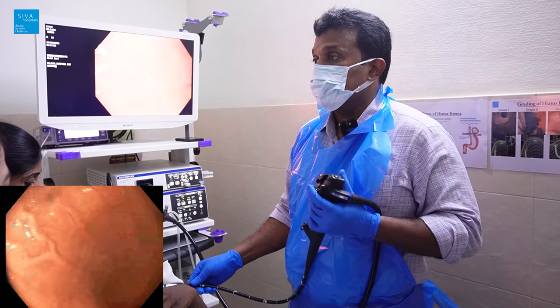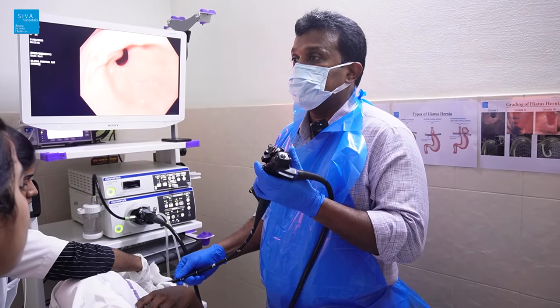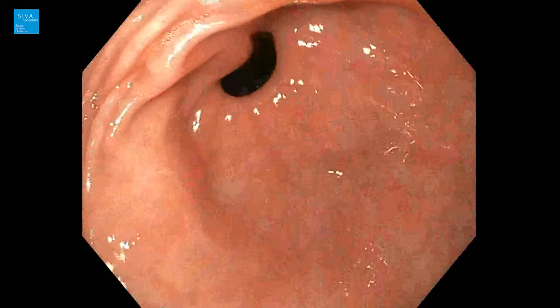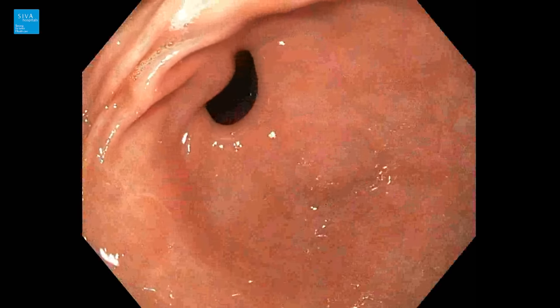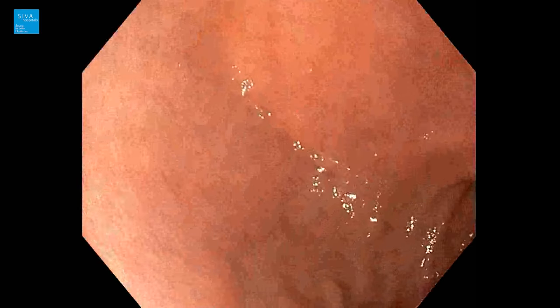This is the body of the stomach; I'm moving toward the antrum. In the antrum, you can see the pyloric opening. I'm entering the pyloric opening and you can see the duodenum. The first part of the duodenum shows some nodule-like structures and inflammation.